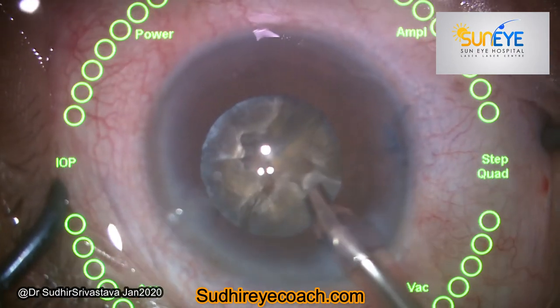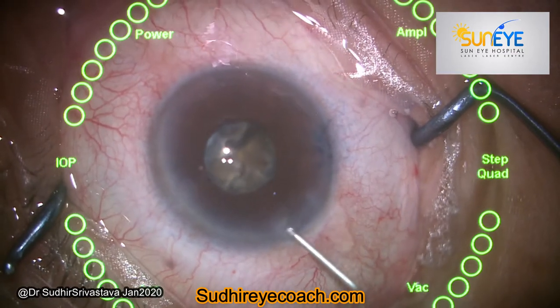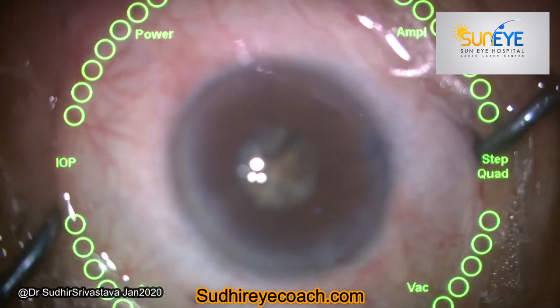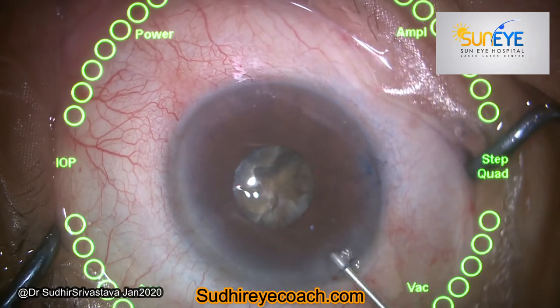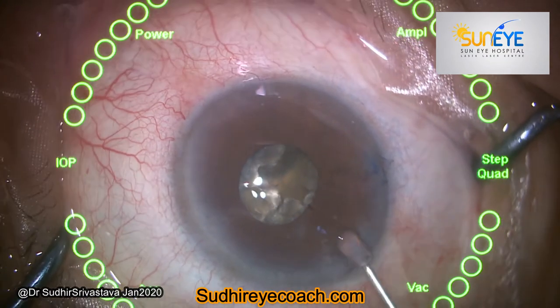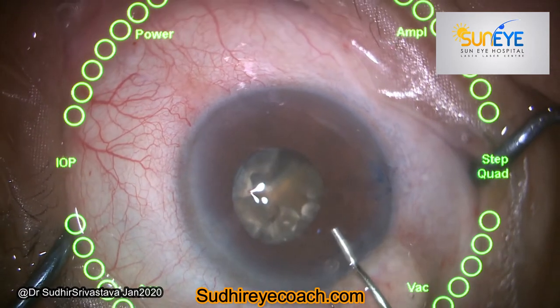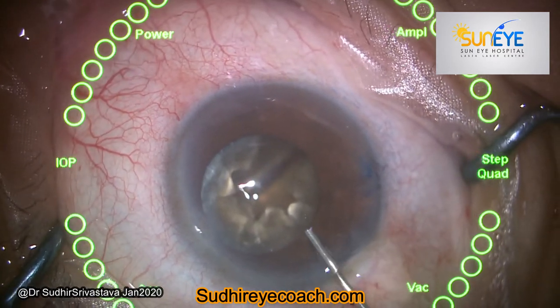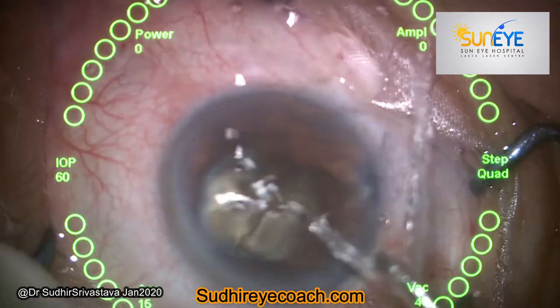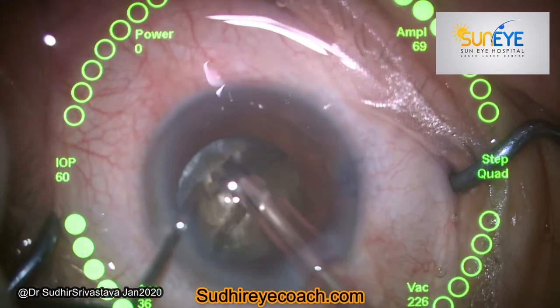Here again I used intracameral mydriatic, and now I am filling the chamber with a combination of dispersive and cohesive viscoelastic. As you fill the viscoelastic, it will dilate the pupil.